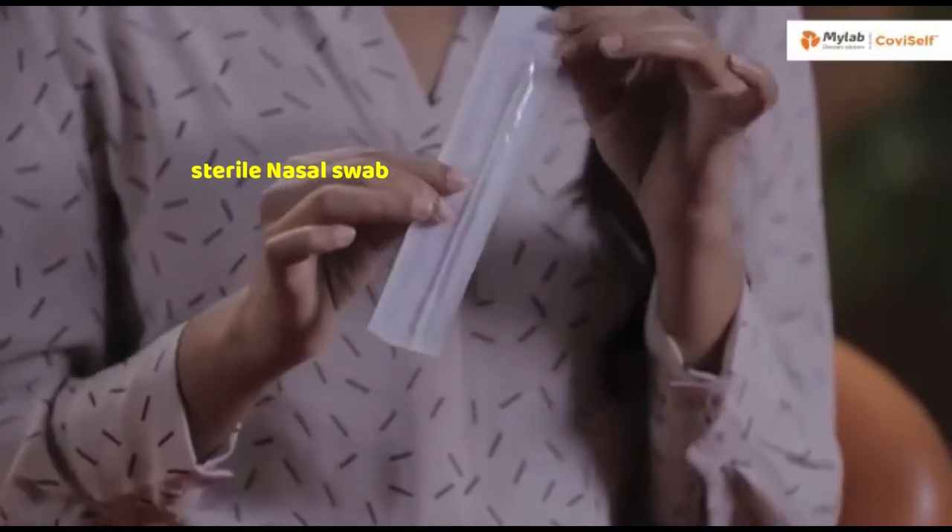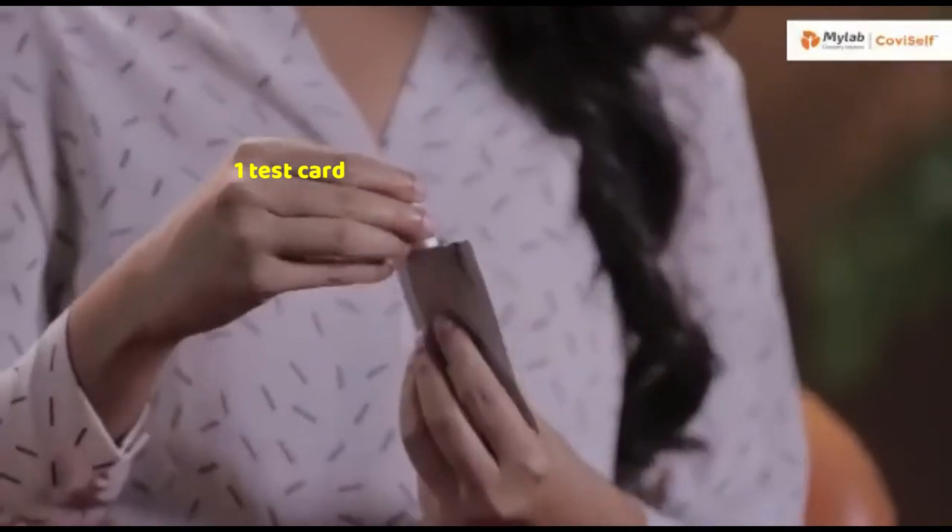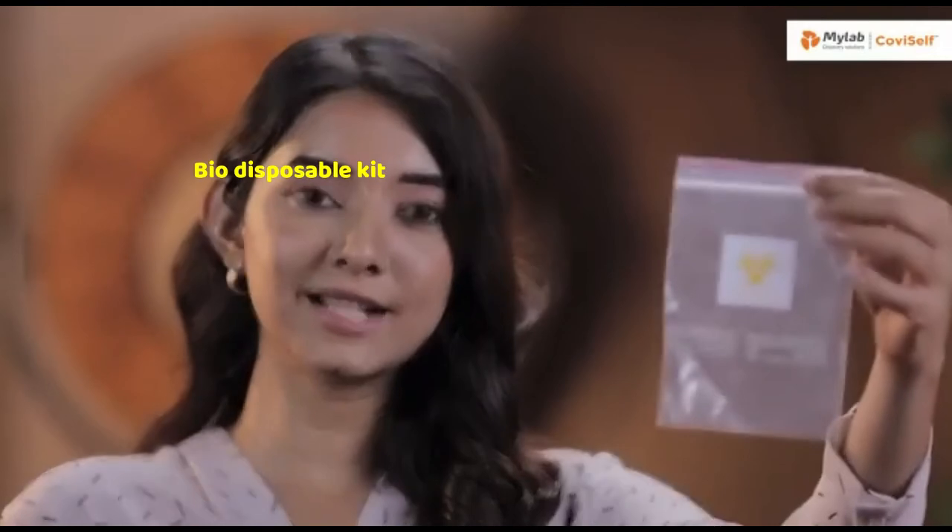As you can see, it has two sides. One is the plastic side and the other one is the paper side. One test card. This is a biohazard bag.